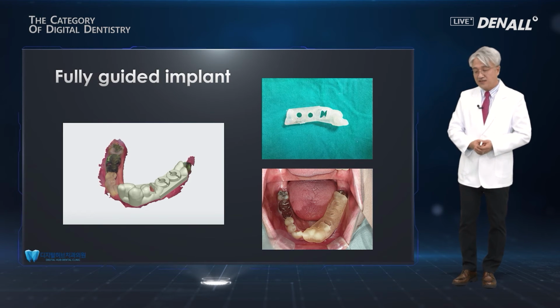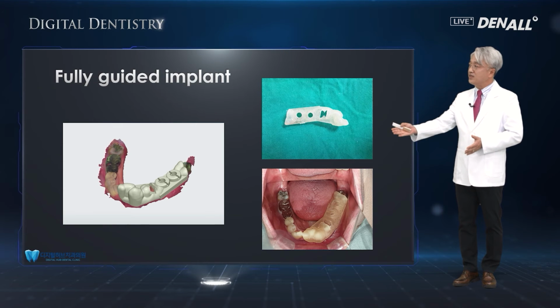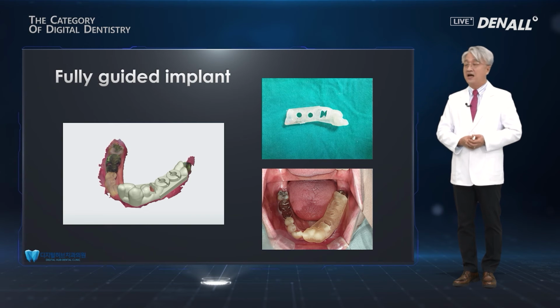Now in implant surgery, digital implant guide surgery, the OneGuide type of guide is used a lot. So using a 3D printer in your clinic, doing guided printing is another area that's very popular in digital dentistry.